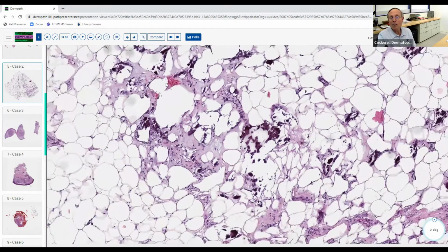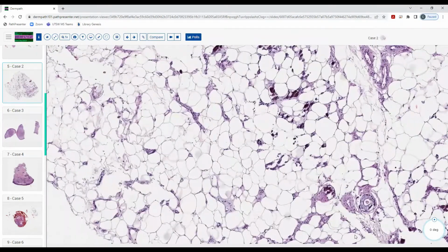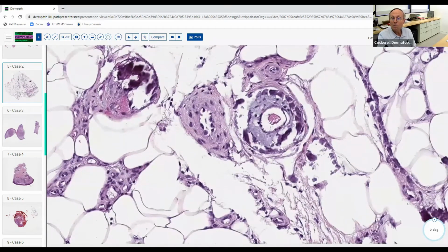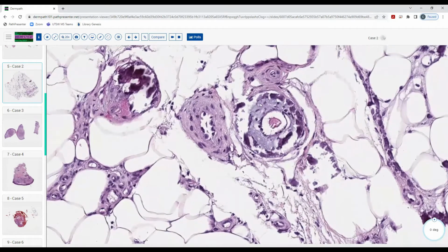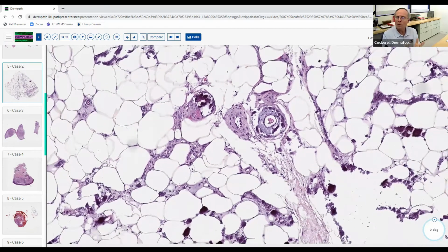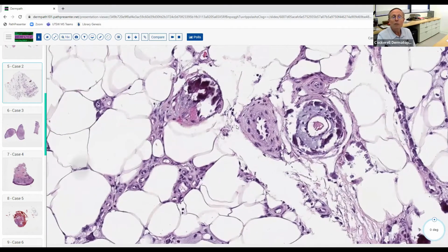Notice where it's diffusely deposited here. And here, you've even got some in these areas right here. The vessels almost. Yes, that's in a blood vessel, and it's a small blood vessel, which is important because you can see calcification of relatively large blood vessels in patients that have atherosclerosis. Monckeberg's calcification doesn't really mean anything. But if you get diffuse calcification like you see here, and these small blood vessels are calcified, and there's a small thrombosed capillary here.